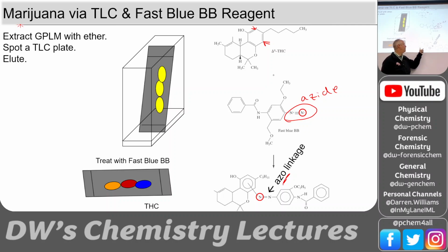I mean, they didn't point here, they didn't point here. So we know it's bonded to that aromatic ring, and it's probably not displacing these 2 items. So it's going to be on that carbon or that carbon. These other items, that's the little wiggly tail on the cannabinoid, okay? But this guy right here changes quite a bit depending upon the different cannabinoids. And also this ring here can open up or close, whether it's CBD or THC or those kinds of things. So this ring can be different. And those are the things that create the different colors.